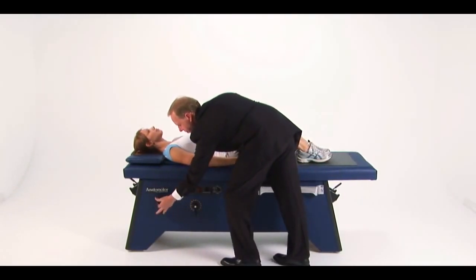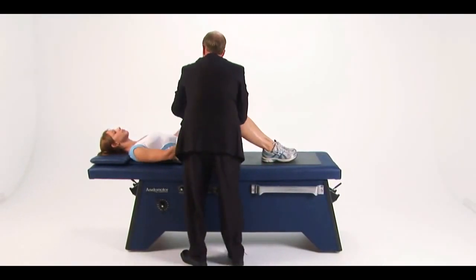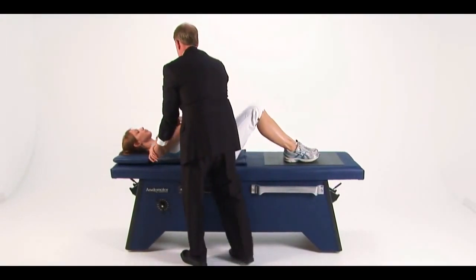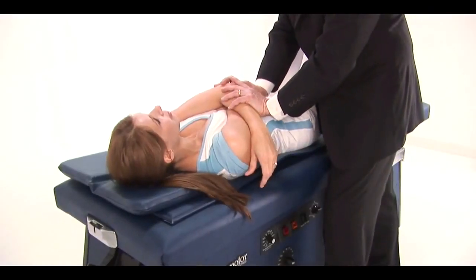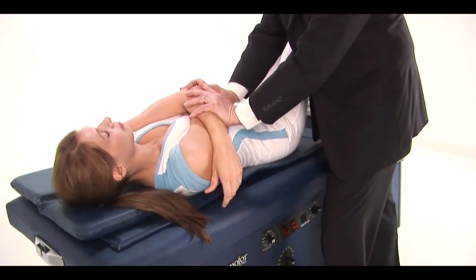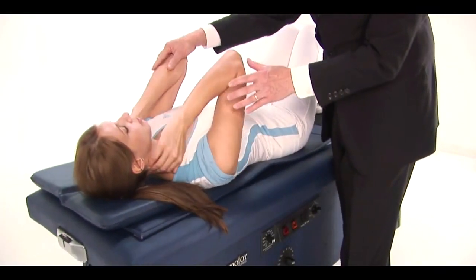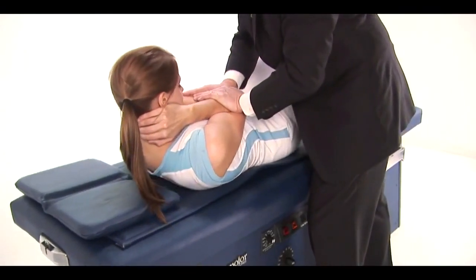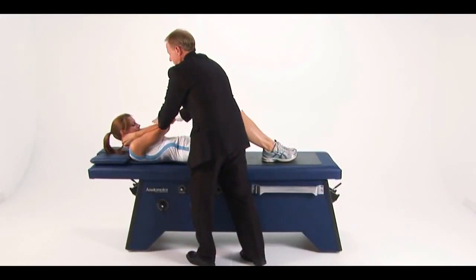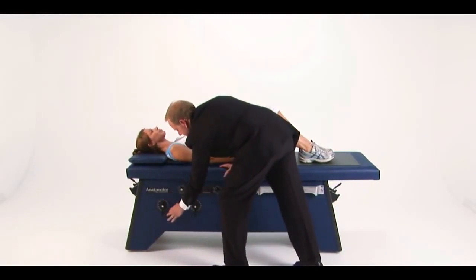Several specific manipulation techniques are easily performed on the Anatomotor. The bottom set of back rollers can be lowered completely and the top rollers are then raised 2 or 3 numbers. The top rollers will now have the same fulcrum effect as placing your hand or fist behind the patient. For a general dorsal correction, apply manual pressure to your patient as they glide towards the head or cervical table position. Release this manual pressure as the patient moves back to the foot or lumbar end.